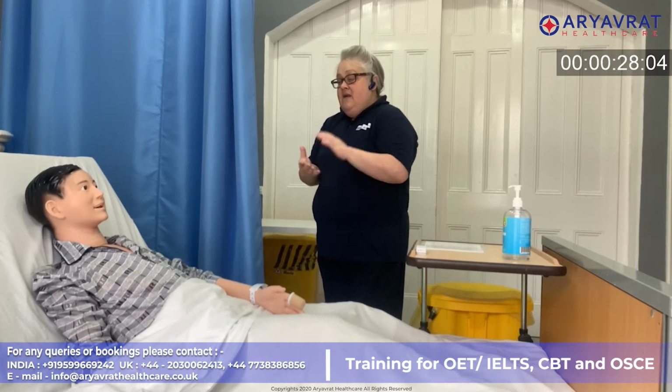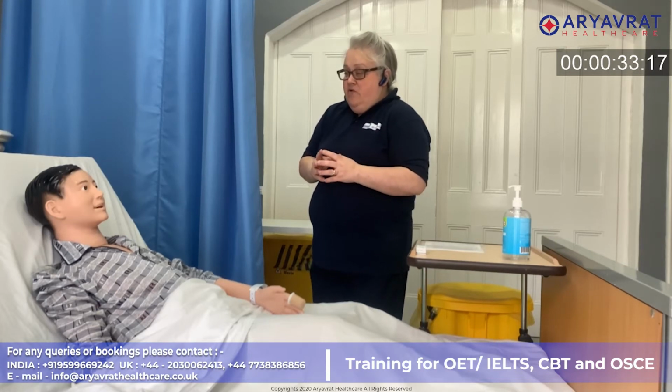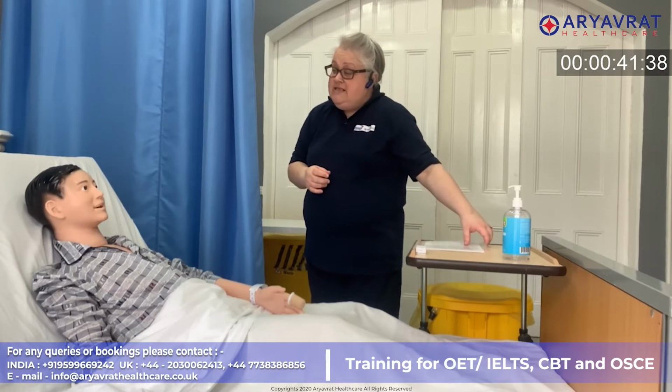Ali. Okay, lovely. I've come here to test your blood sugar level at the moment before you have your lunch. Is that okay? Yeah, that should be fine. Have you had this test done before? Oh, yes, I have. Okay, so I'm just going to go and grab the equipment. Whilst I'm away, do you mind washing your hands with some warm soap and water and making sure they're dry thoroughly? Is that okay? Okay, that should be fine. You're mobile enough to do that? Yes. Okay, lovely. I'll be right back with your testing kit then.